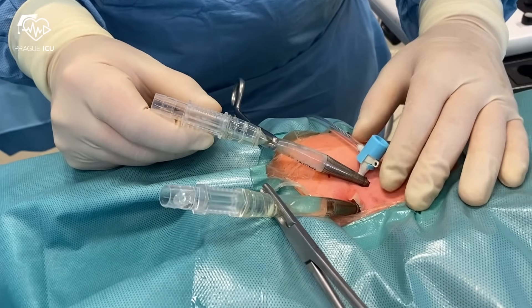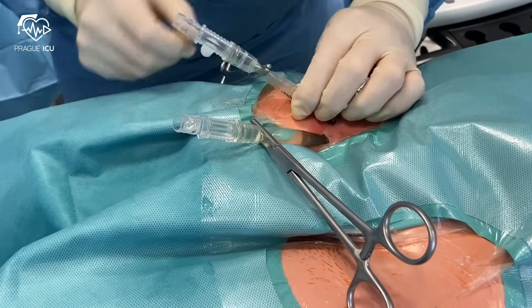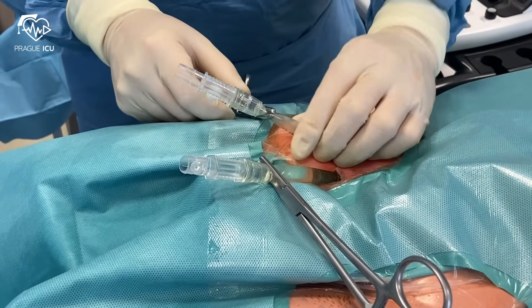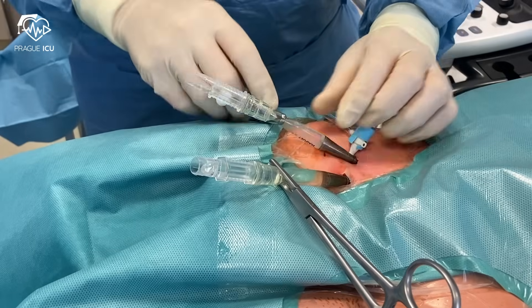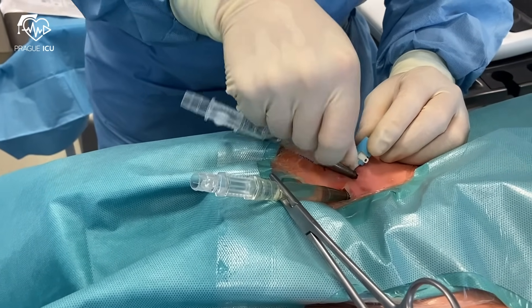If you have time, secure both cannulas in the groin before starting the ECMO. This is obviously not the case during ECPR, during which we prefer starting the ECMO bypass as soon as possible. In this scenario, we need to hold tight both cannulas, especially the arterial one, which can be easily pushed out by the blood flow.